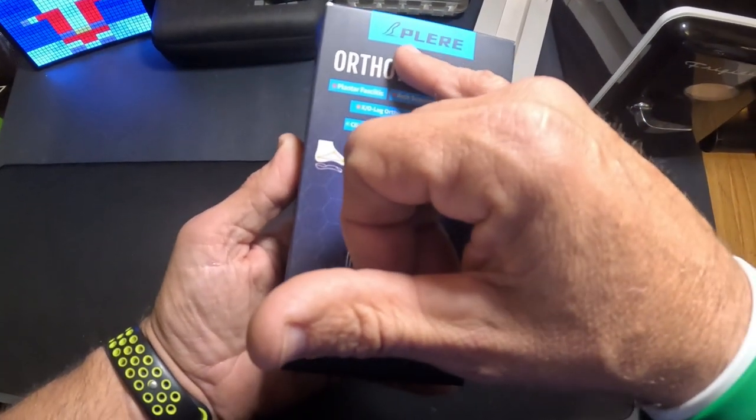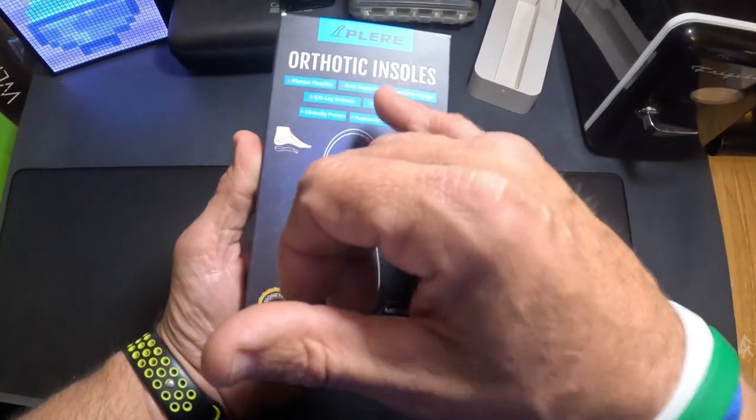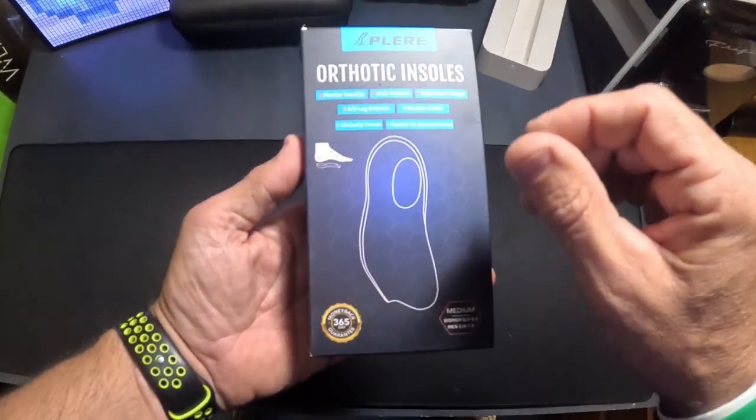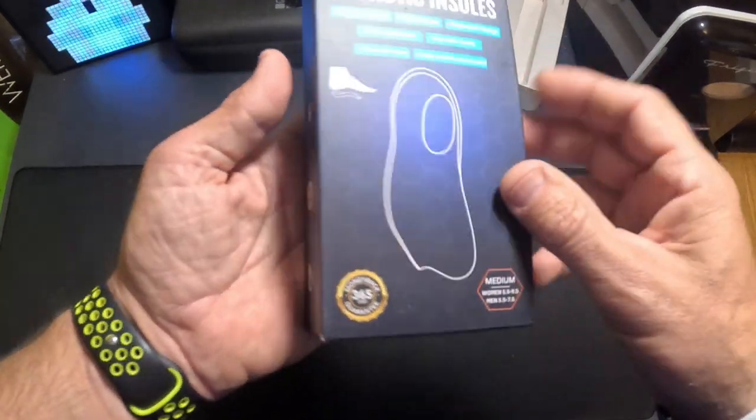This is from the company Plere, and it gives you a lot of arch support and a more ergonomic design inside the shoe. You can kind of see the shape of it right there.